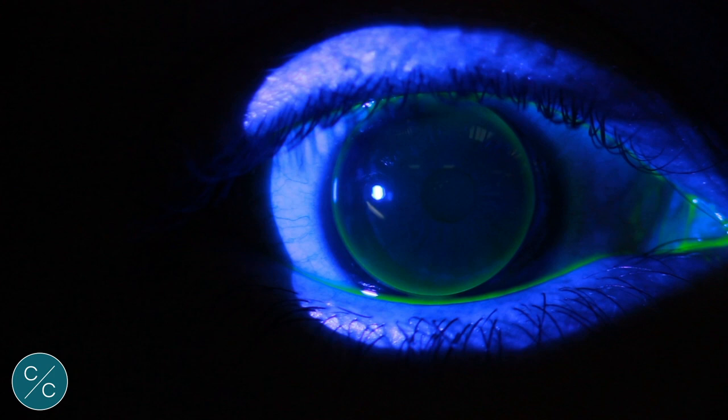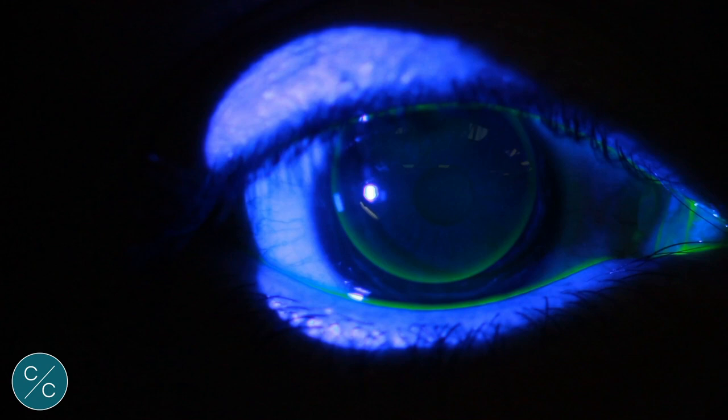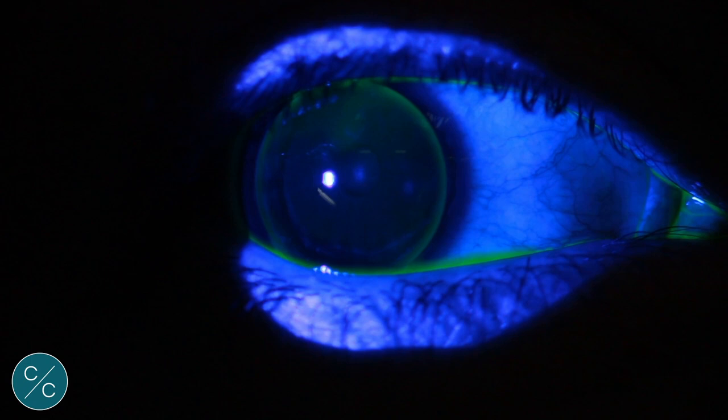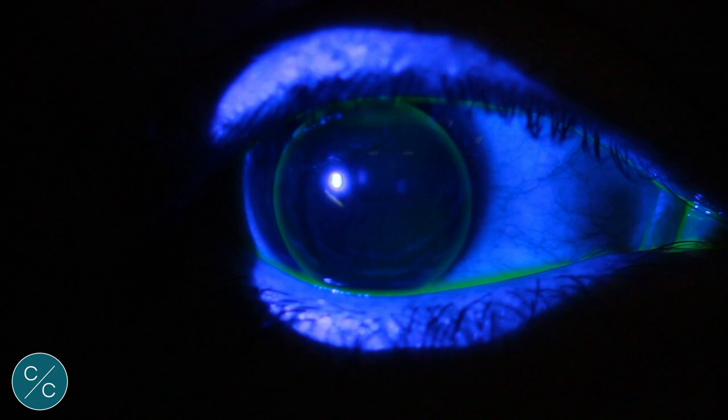Here we have an 8.0 base curve lens on the eye and immediately we can see an improvement. Less clearance top and bottom and the lens is centering better. However, it still prefers to rotate around the apex of the cornea rather than across it, as we can see at this section here. So better, but still not as we'd like — we'll steepen it a fraction.